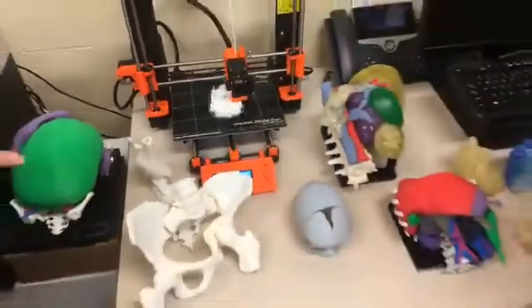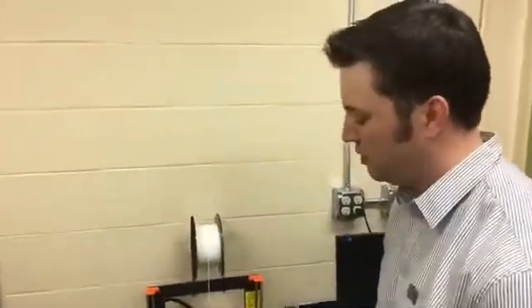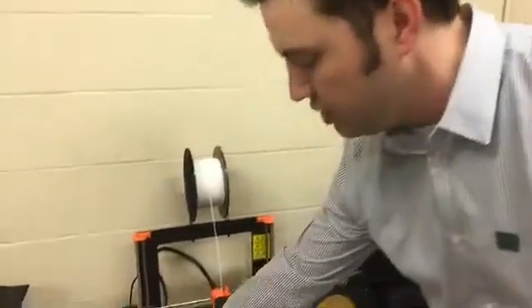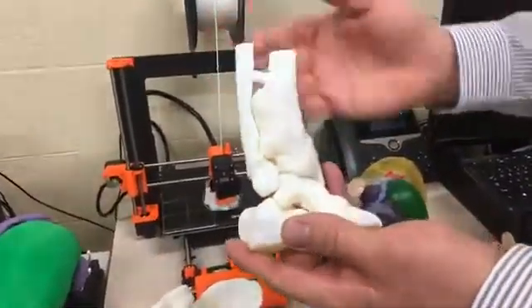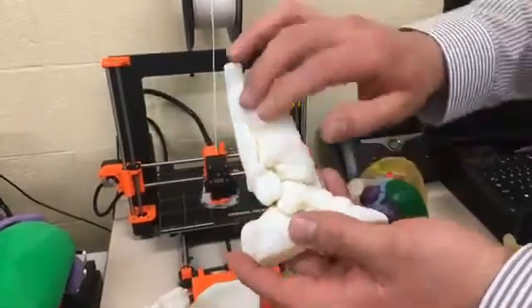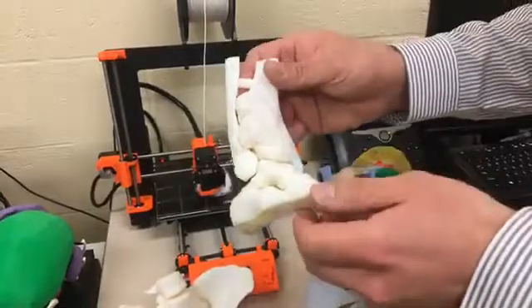Yeah, and it looks like orthopedics has worked with you as well. What do we got here? Yep, so Dr. Esposito reached out to us on a couple of tough cases, and we were able to do this. This is an ankle that had to be reconstructed. You can see there were some issues here with bony growth that had come in. He had to reshape this to open that ankle up so that the mobility in the ankle could be restored.